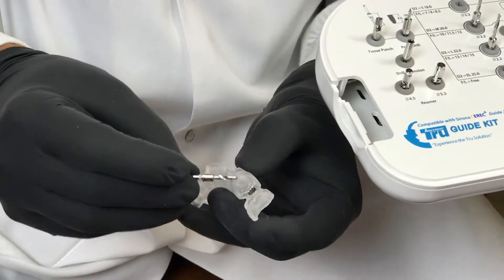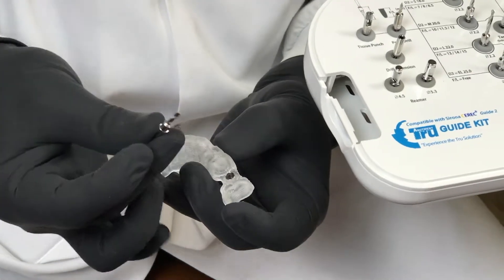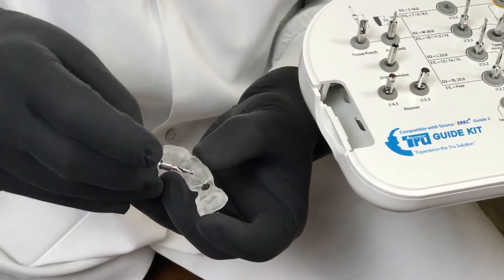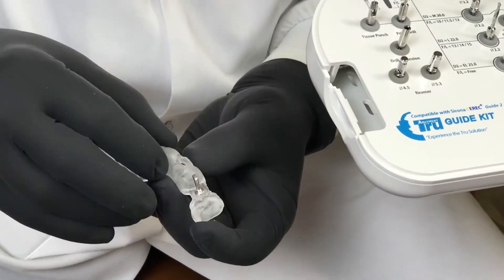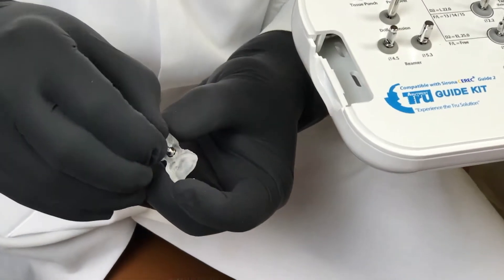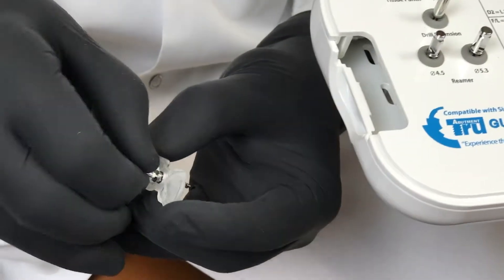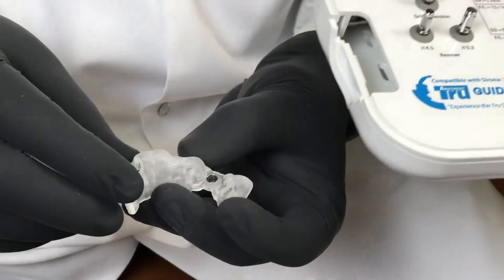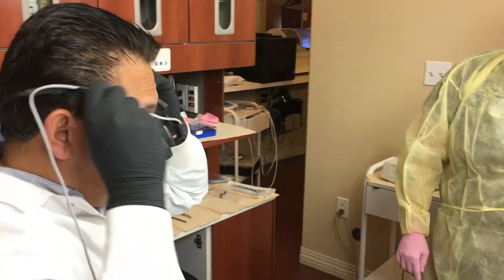The reason I like the D218 is that many of our patients have some limitation of opening, and using this small pilot drill, we can start doing our osteotomy. From there, we can move on to any other D2 — it can be the 20, the 22, or the 25. So now let's proceed to do our surgery.